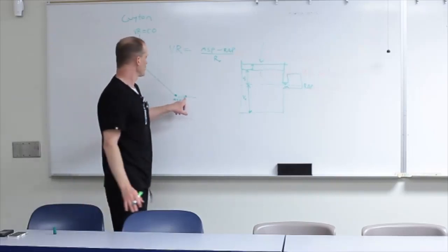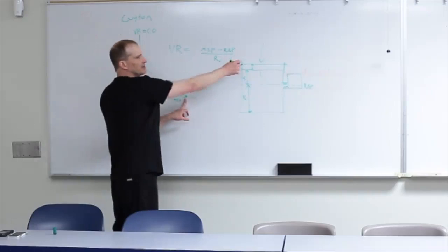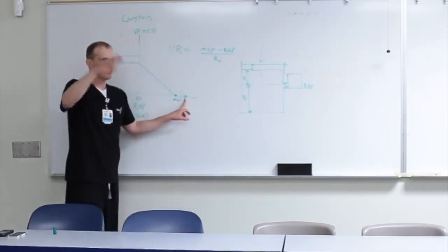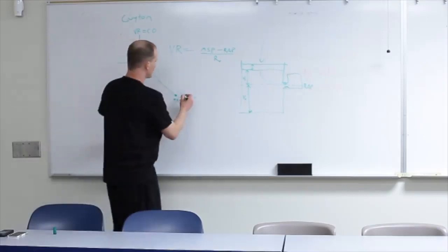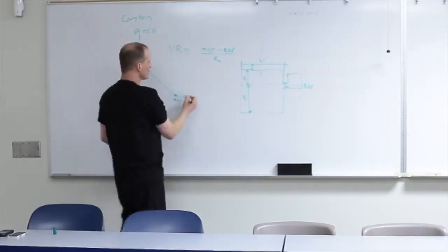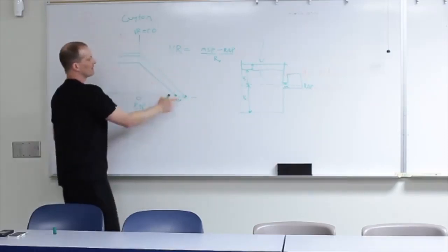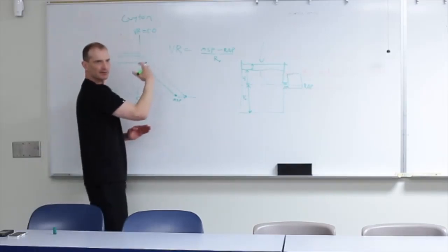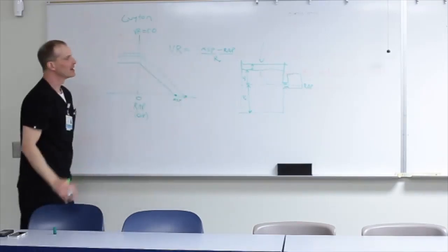Additionally, and this is kind of getting a little bit nitpicky, but because we watered down the blood and made the hematocrit go down a little bit, we made the blood less viscous, and so we actually did change the resistance of the slope, because part of what resistance is, is viscosity. So we actually kind of went a little bit here too, because we've changed the slope. This is the slope, this is the difference between these two, okay?